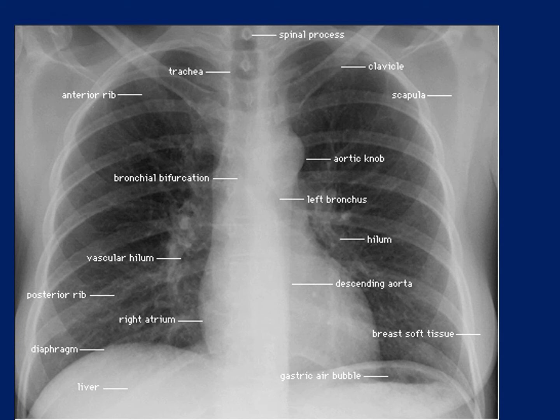So this gives you some different landmarks here. You can see the little gastric air bubble on the left side, and the liver, which is pushing up the diaphragm on that right side.